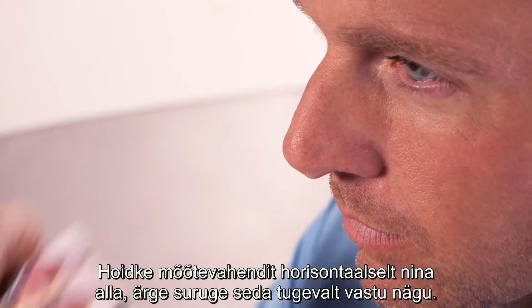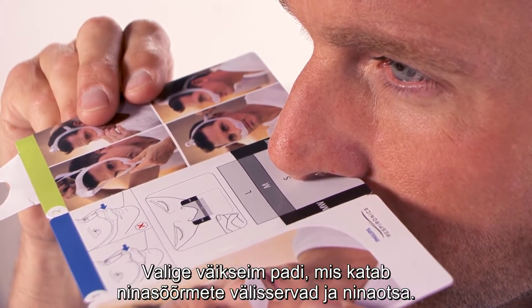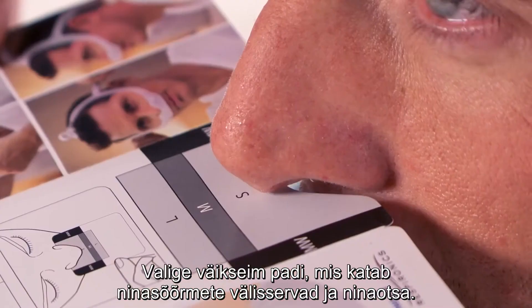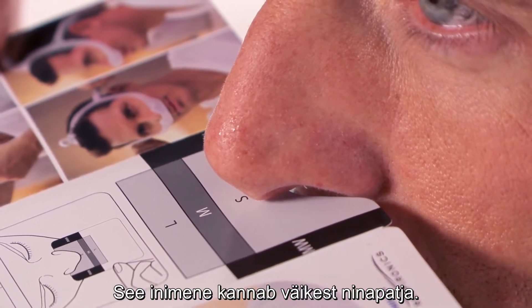Hold the gauge horizontally under your nose without pressing it into your face. Choose the smallest cushion that covers the outer edge of your nostrils and the tip of your nose. This person wears a small.